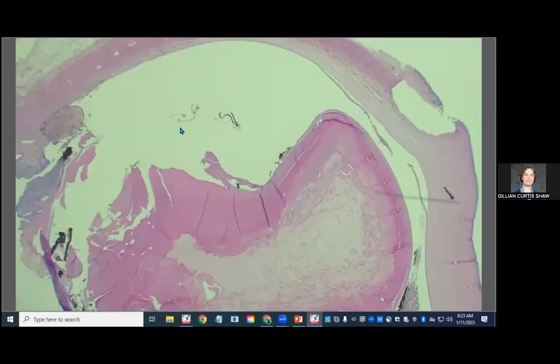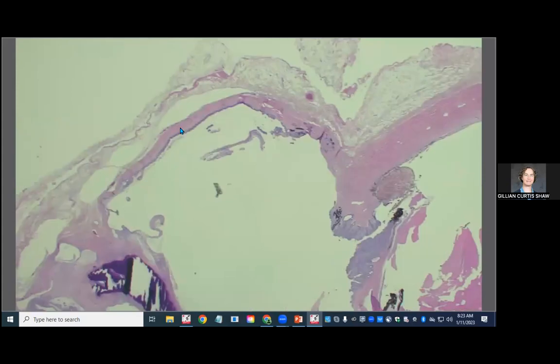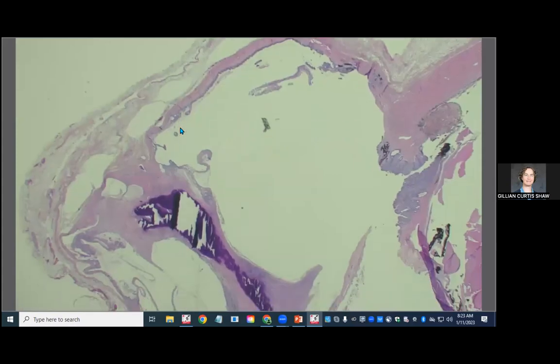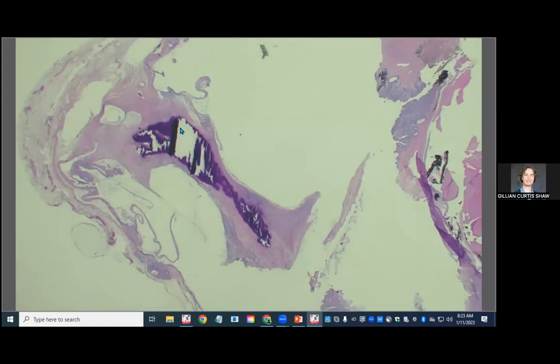Anterior segment is kind of poorly formed on one side. And then this outpouching, which you probably all had in mind for this whole time, is a coloboma. It's pretty common to see colobomas back where the optic fissure would have been. We didn't actually see a recognizable optic nerve in this case. It's basically all just kind of occupied by this coloboma.